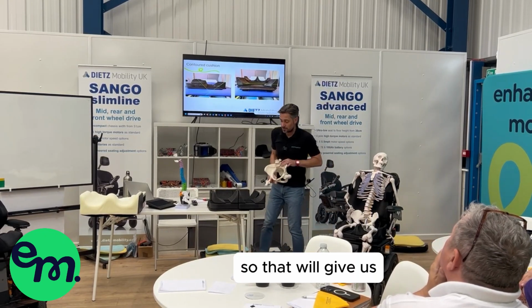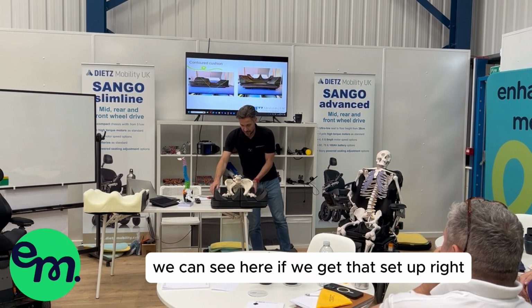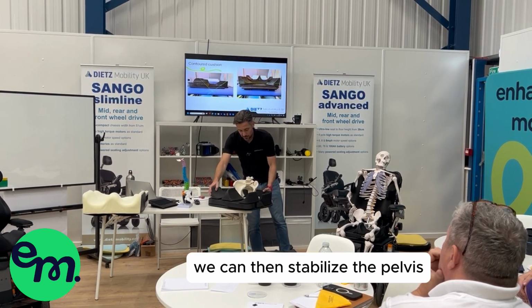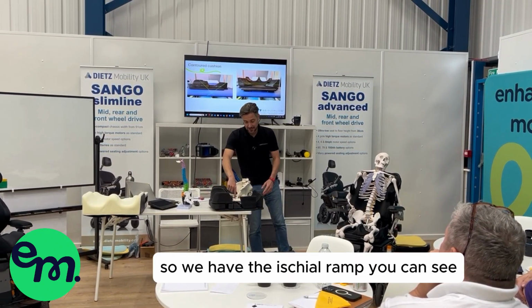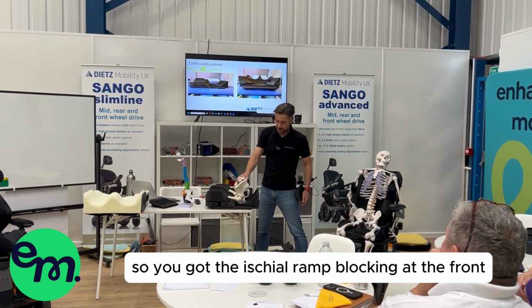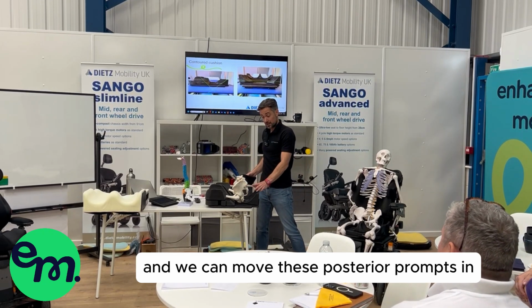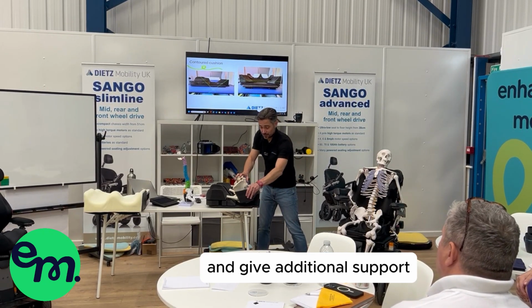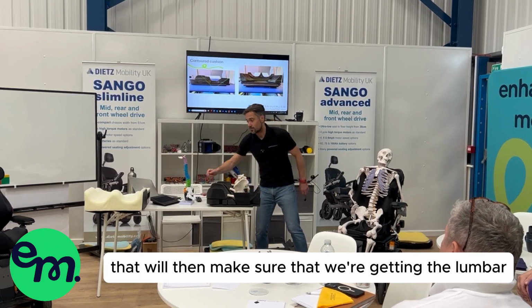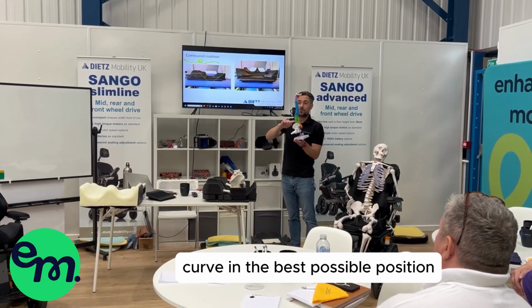So that will give us, we can see here, if we get that set up right, we can then stabilize the pelvis. So we have the ischial ramp, you can see. We've got the ischial ramp blocking up front, and we can move these posterior prompts in to really guide the pelvis and give additional support. That will then make sure that we're getting a lumbar curve in the best possible position.